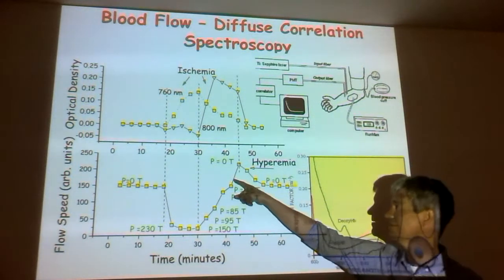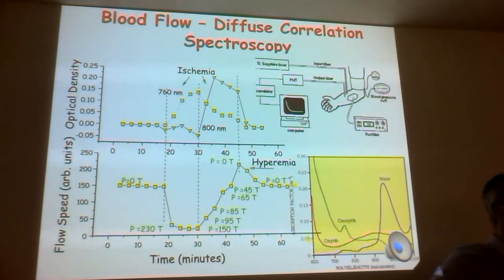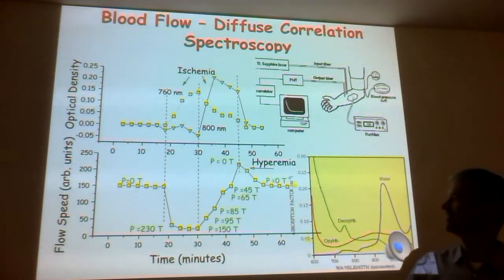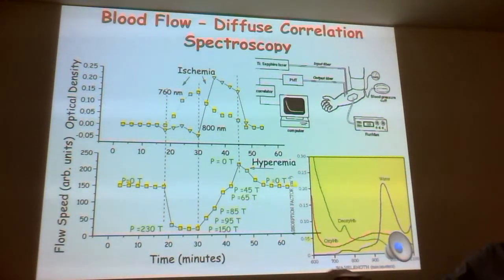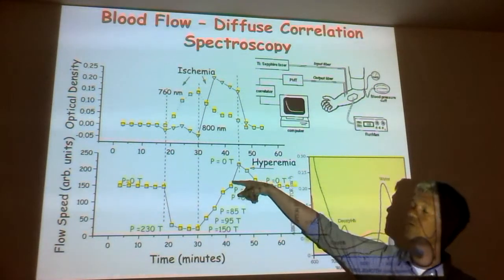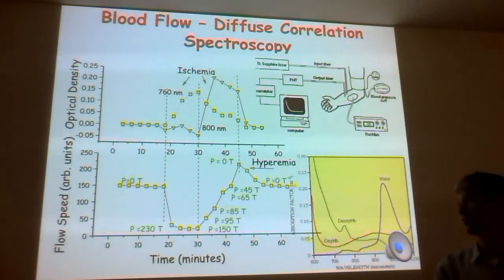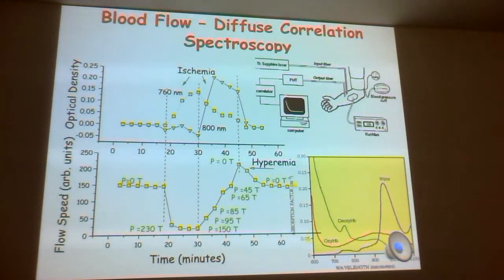The measurements were really slow at the time, so we only got 4 data points in those 10 minutes. The blood flow physiologically just increases to deliver more oxygen to the muscles to help them reoxygenate.